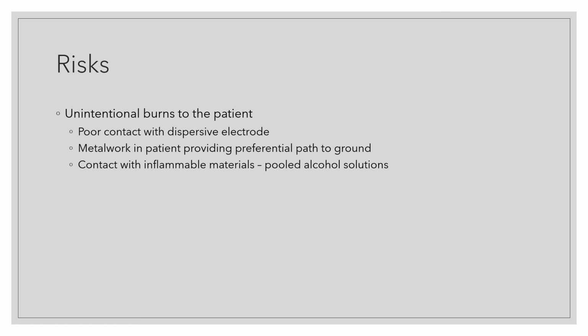And finally, contact with inflammable materials, as you might expect, for something which burns, tends to end poorly for all concerned. And most famously and most notoriously, that's contact with pooled alcohol solutions, for instance, the alcoholic chlorhex, which we use to prepare the surgical site. And there have been a number of cases where that's caught fire and given the patient really quite severe burns.